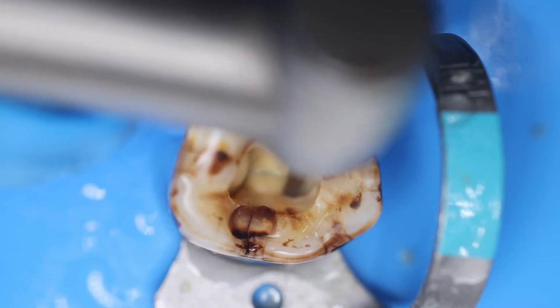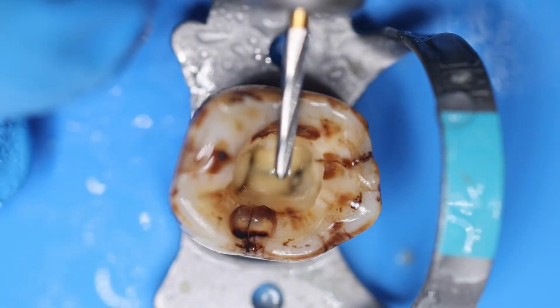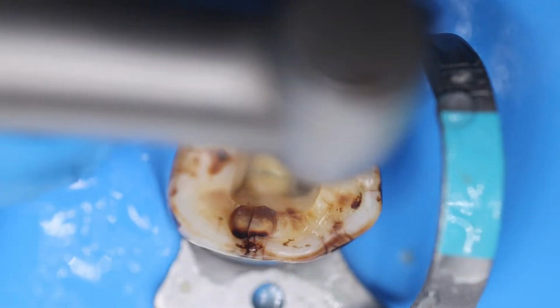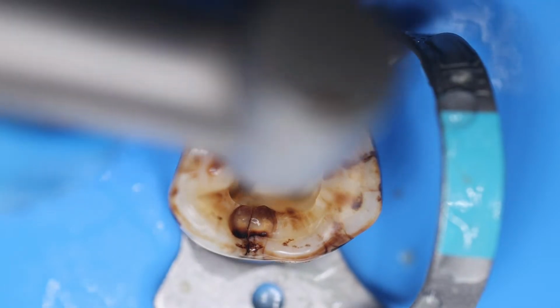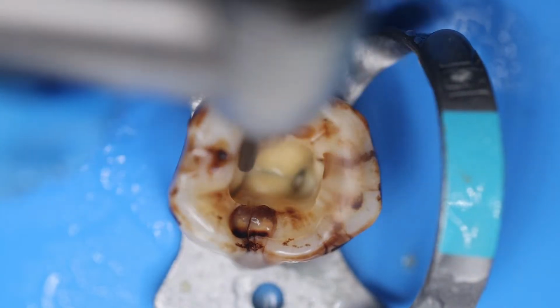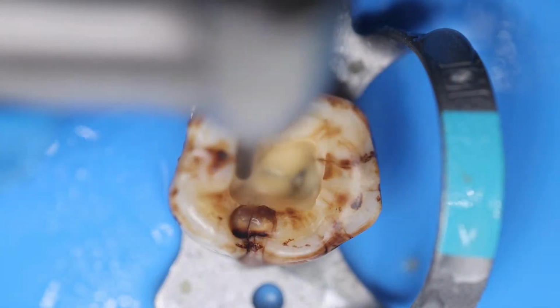Now you can easily move this bar onto the pulpal floor. See, I am moving it onto the pulpal floor because this bar has a non-cutting tip, so it will not harm the pulpal floor. In this way you can use it against the wall so that you can remove any undermined area to have a proper straight line access. See how I am moving it. Just remove the weakened tooth structure that is there, which can be reconstructed later on.